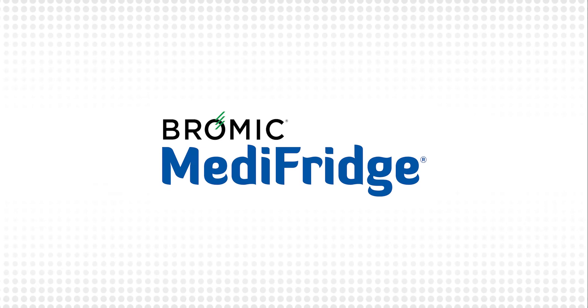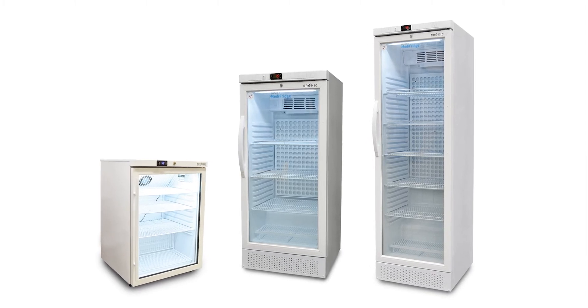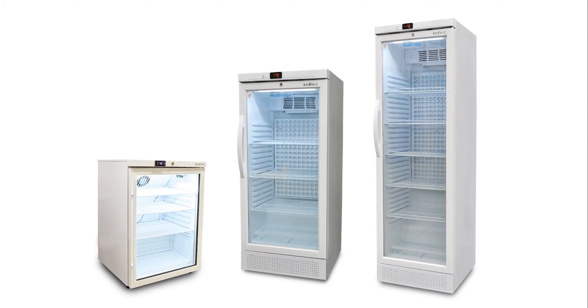Hi and welcome to an instructional video on the Bromic Medi-Fridge. This video will explain how to use the Medi-Fridge to correctly ensure your vaccines are stored safely and following the Strive for 5 National Vaccine Storage Guidelines.